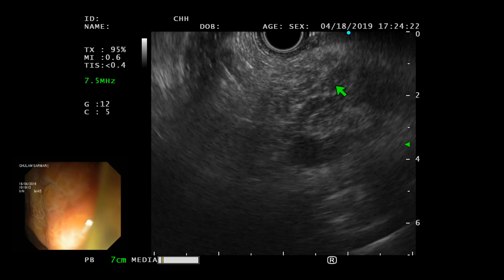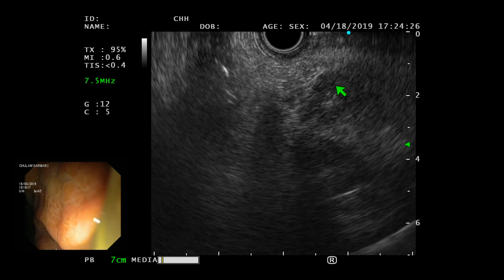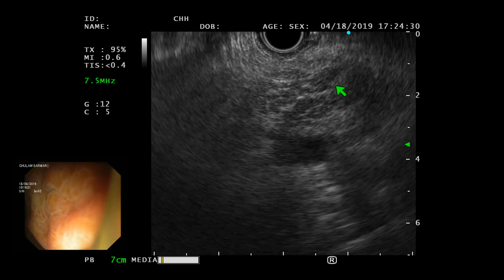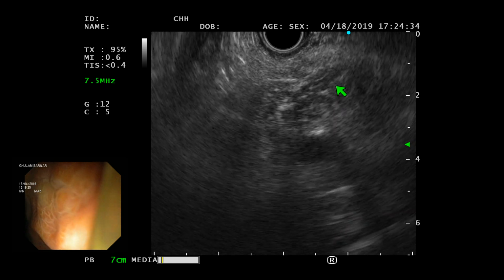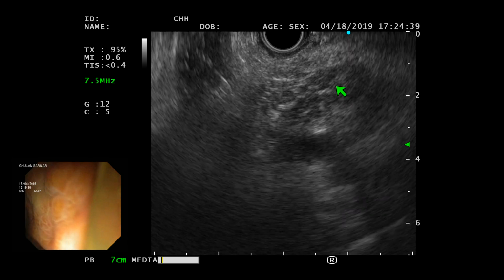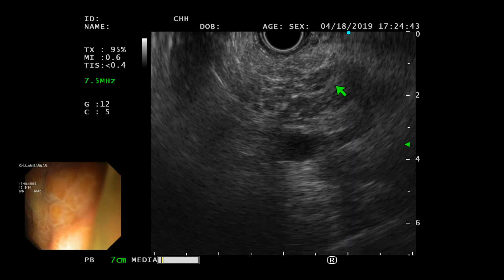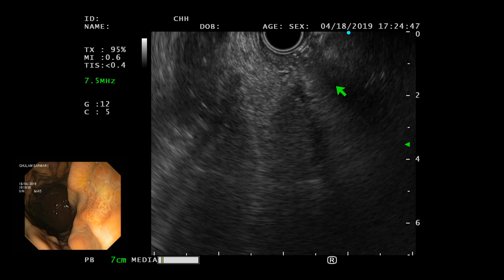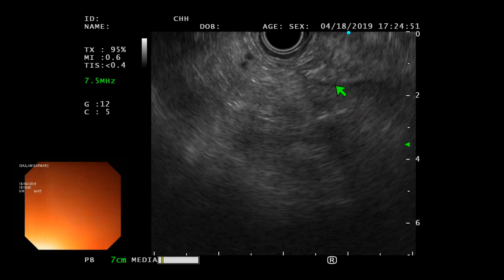And I think Khalid, you've been seeing Pakistani pancreas as much as probably all of us. So again, this is slight lobularity, and no, this is a little more than a Pakistani pancreas. This looks like chronic pancreatitis. I'm going to call it mild to moderate. Yeah, parenchymal changes are certainly there. I don't know, but the duct looks pretty okay from here.